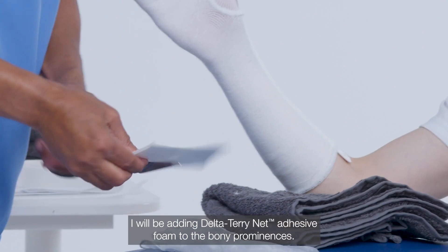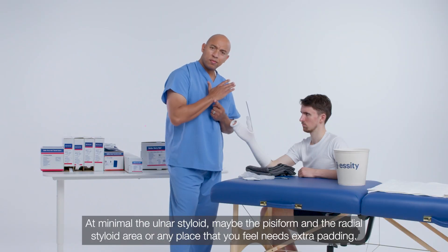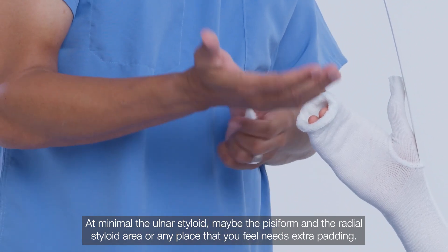I will be adding Delta-Terry Net adhesive foam to the bony prominences — at minimum the ulnar styloid, maybe the pisiform, and the radial styloid area, or any place that you feel needs extra padding.